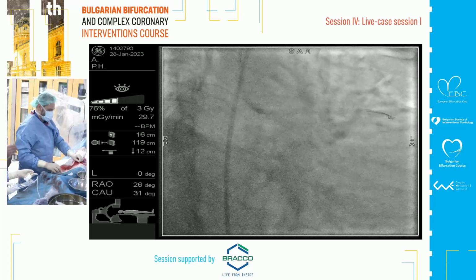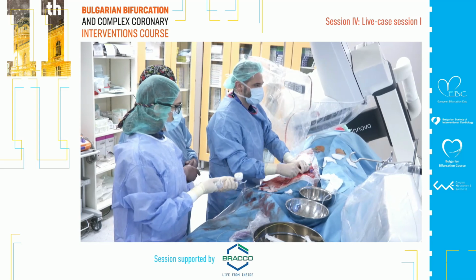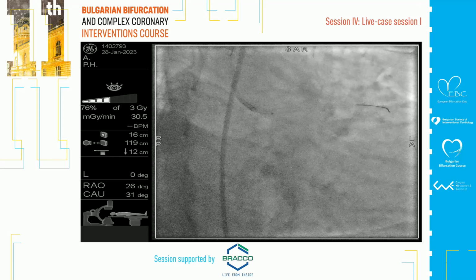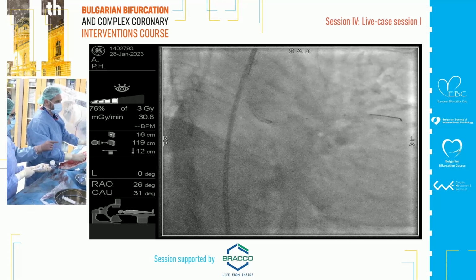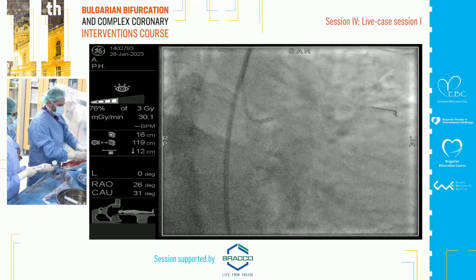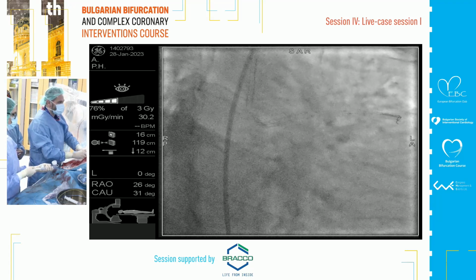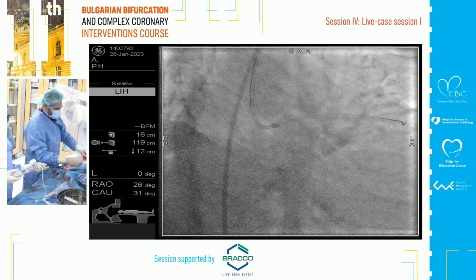And then put the wire just in front of the... So what have you done, Gianluca? If it goes from down up into the... oh, now pull a little bit. We have to remember to push it distally and guide the catheters and wires, and we have to be very cautious. When you pull out, you can destroy the stent implanted in front of the left main because of this longitudinal stent distortion. Yeah, you have to take care.